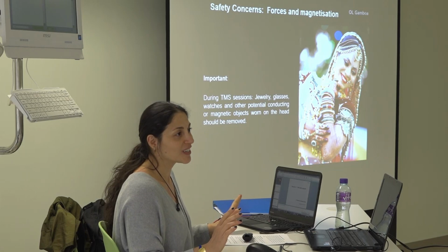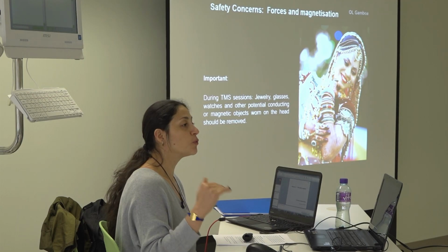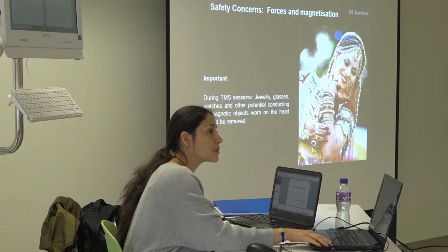That's my suggestion. Okay? So jewelry, glasses, watches, or any potential conducting or magnetic objects worn on the head should be removed. You don't want to cause any harm to this person, okay?